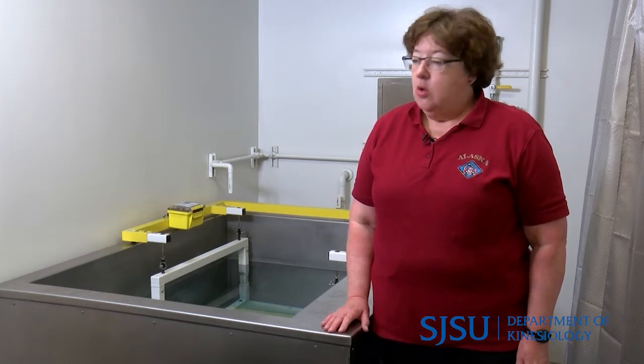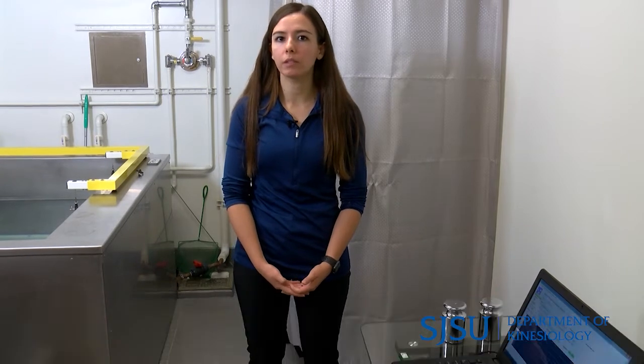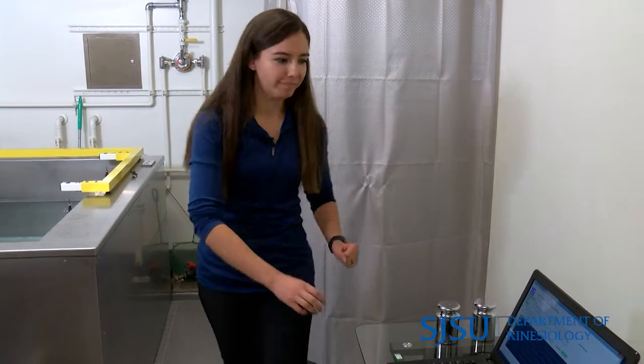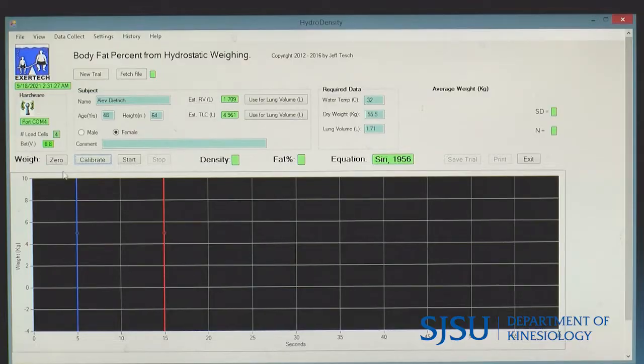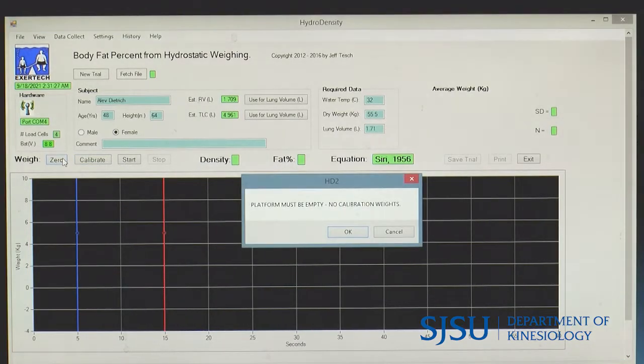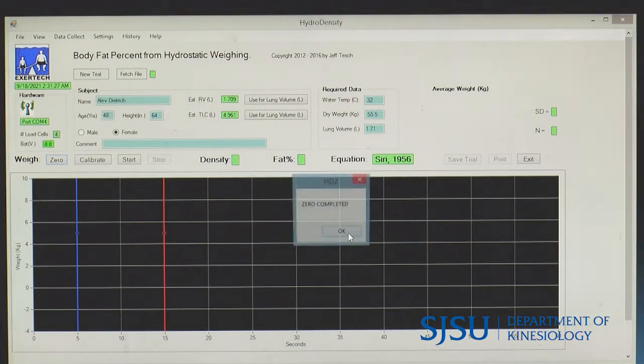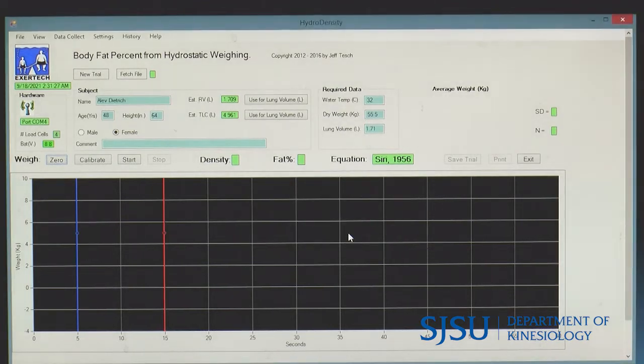We are going to zero the platform. The platform weighs a certain amount underwater and we need to subtract that amount from Alev's weight. I'm going to click zero — I need to ensure there are no calibration weights on the tank and nothing resting on the white bars. Zero has been completed.